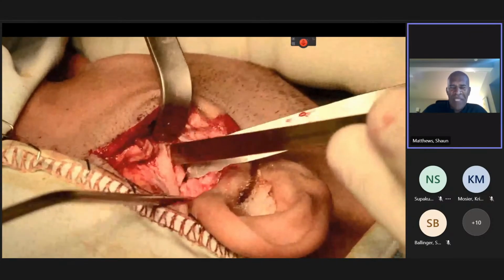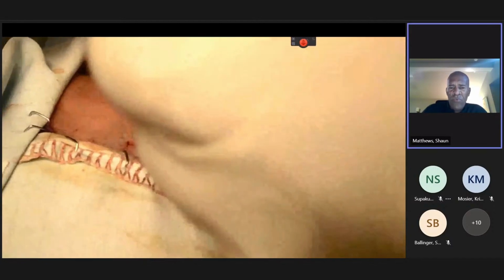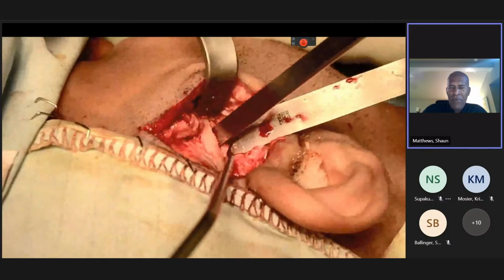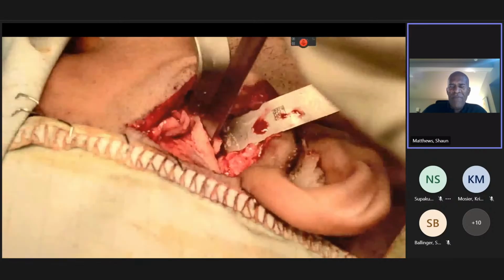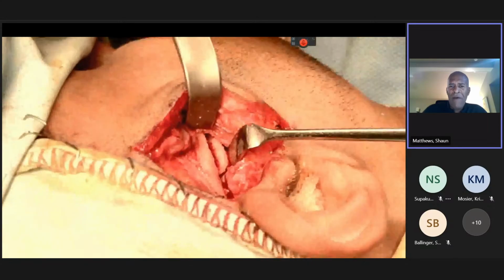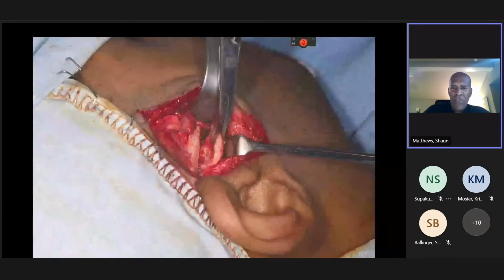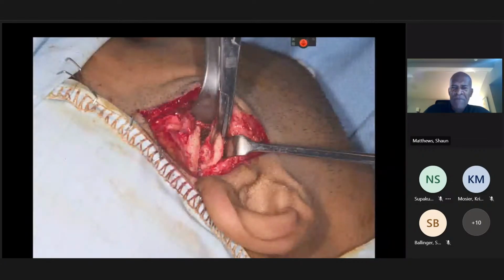It's a bit like sculpting, isn't it, really? And then we are going to just very gently remove the articular eminence shown here. The bone is now free, and retrieve that eminence. And now we have a nice clear ledge of bone above and no evidence for that condyle to be displaced or dislocated in front of.